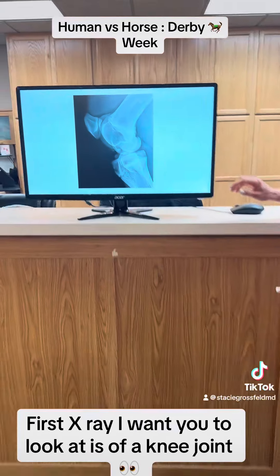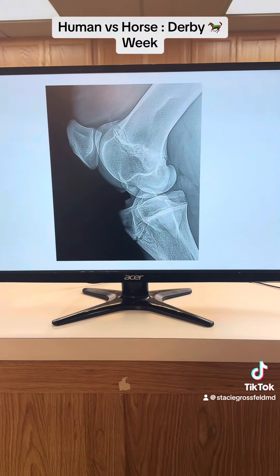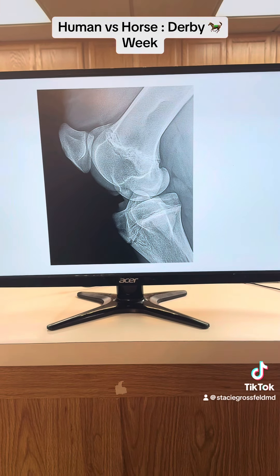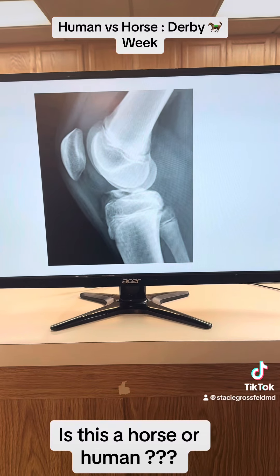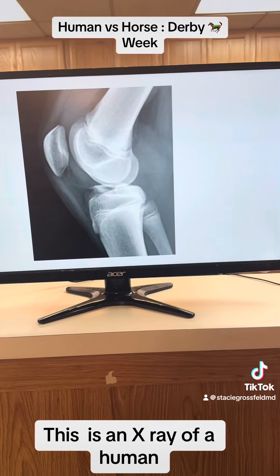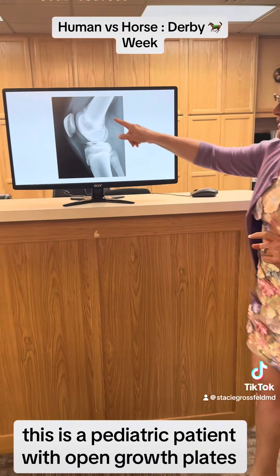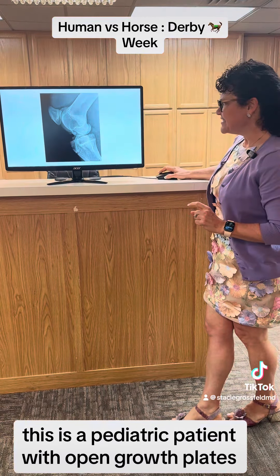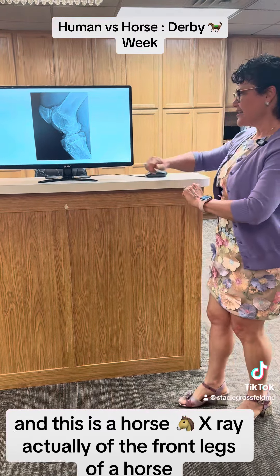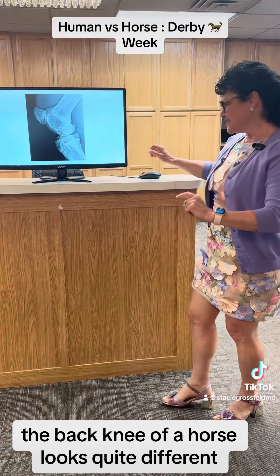The first x-ray I want you to look at is of a knee joint. Is this a horse or human? This is an x-ray of a human — a pediatric patient with open growth plates — and this is a horse x-ray, actually of the front legs of a horse. The back knee of a horse looks quite different.